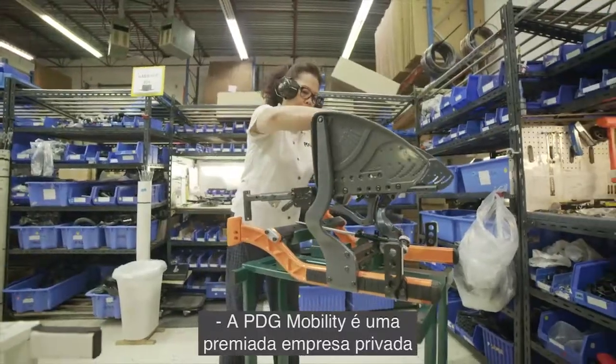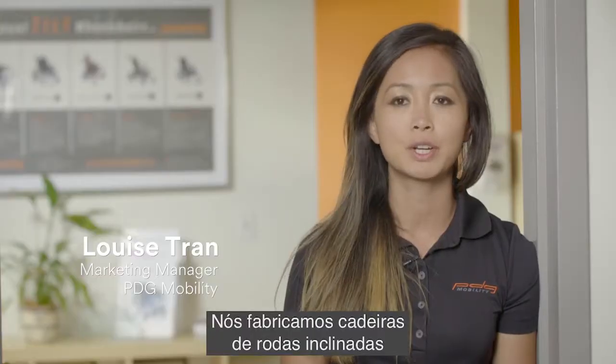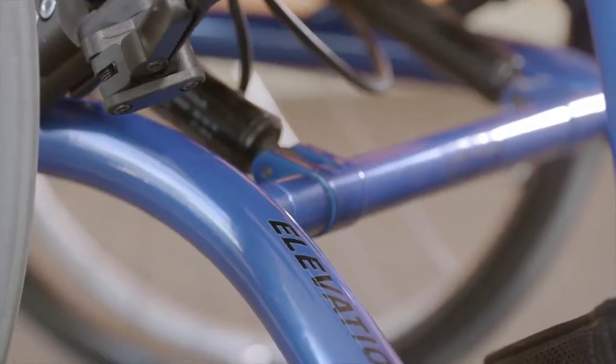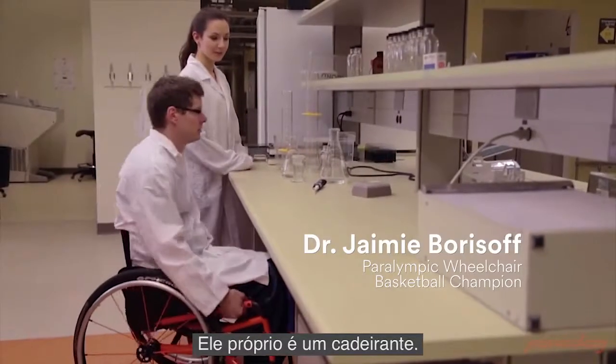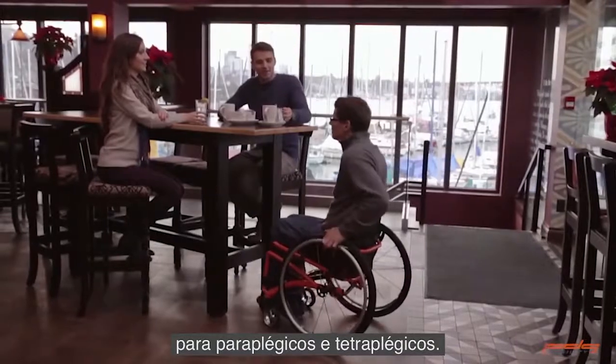PDG Mobility is a privately owned, award-winning, Vancouver-based company. We manufacture tilt-in-space wheelchairs and we have one ultralight rigid chair. The elevation was designed and invented by Jaimie Borisoff. He himself is a wheelchair user, and it was designed to provide mobility to paraplegics or quadriplegics.